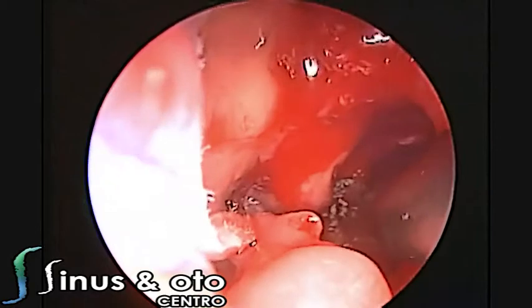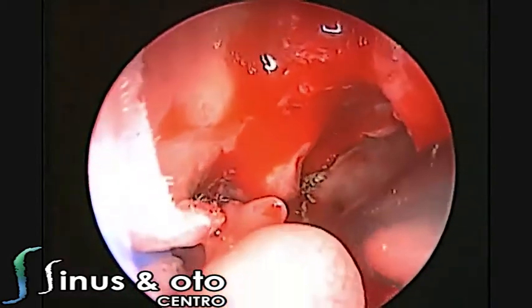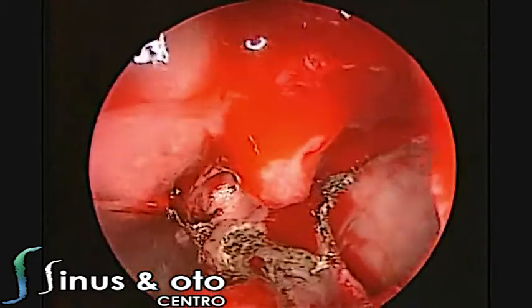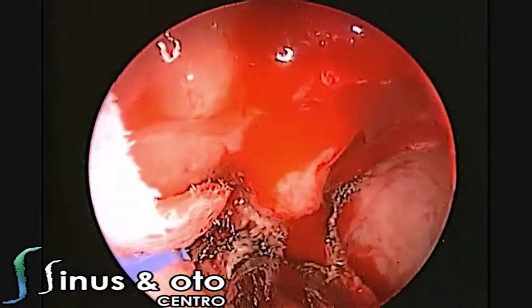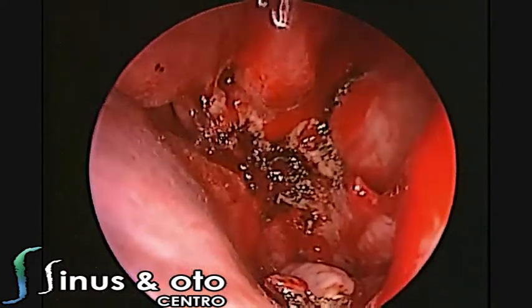We are also cauterizing the borders of the antrostomy — the posterior borders of the maxillary antrostomy. We are removing now the middle turbinate of the left side in order to gain space.